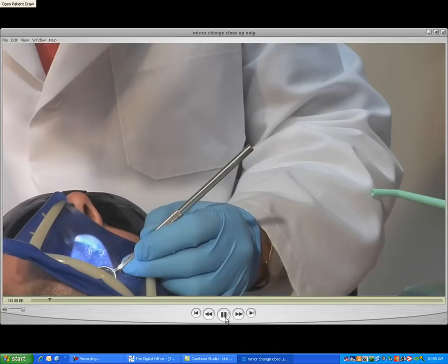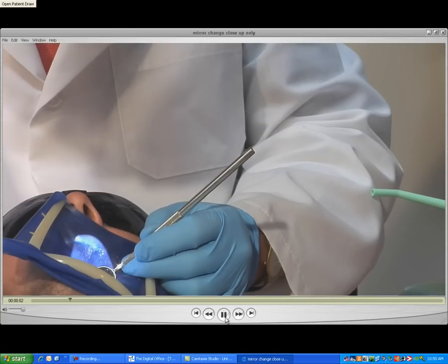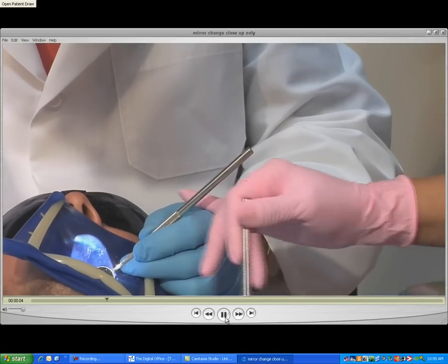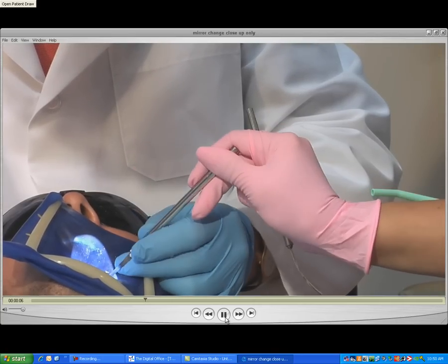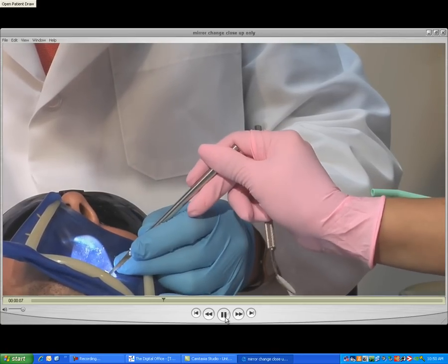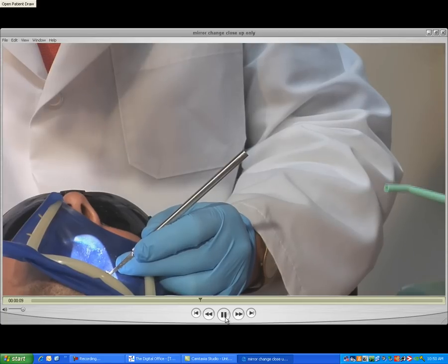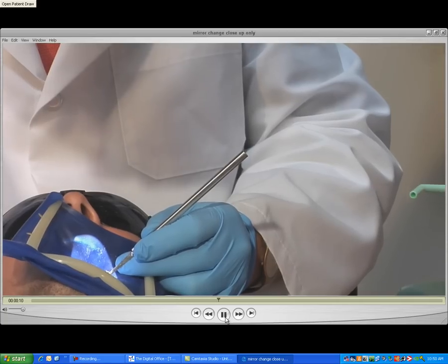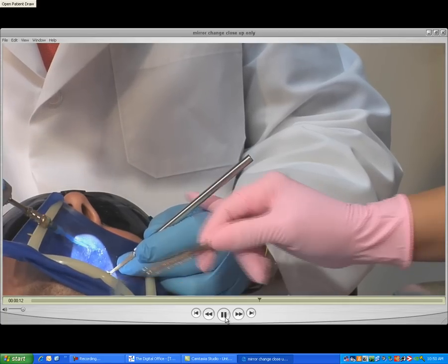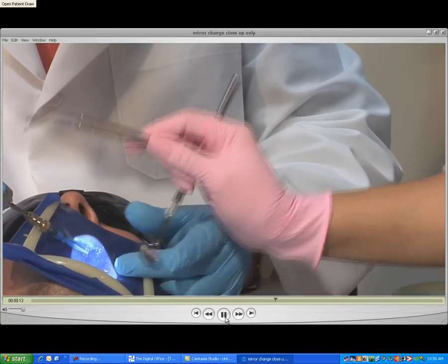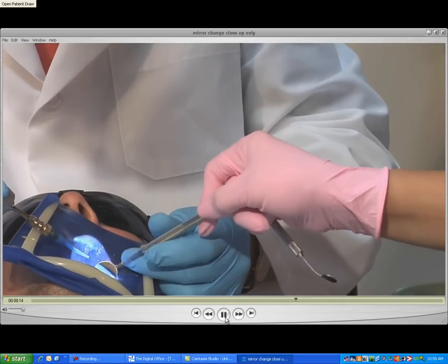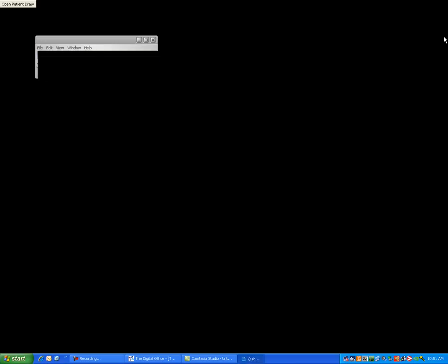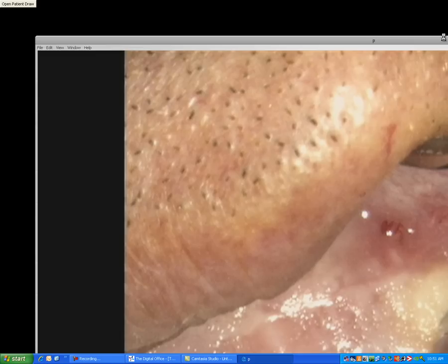Click my mouse. And this is bringing up another video. I'm going to click my play button. This is a video of Dr. Carr showing how to change the instruments. I'm going to close that video.